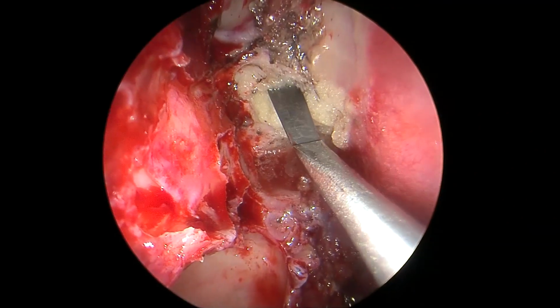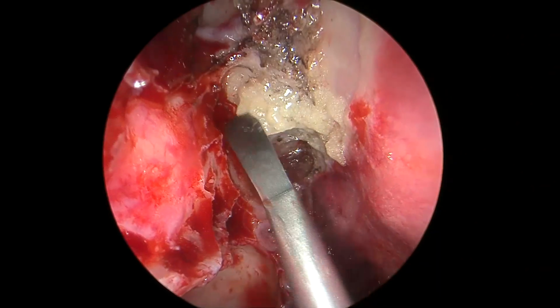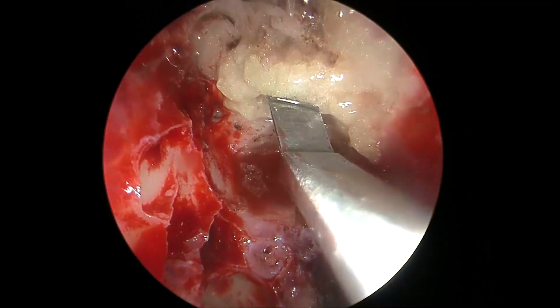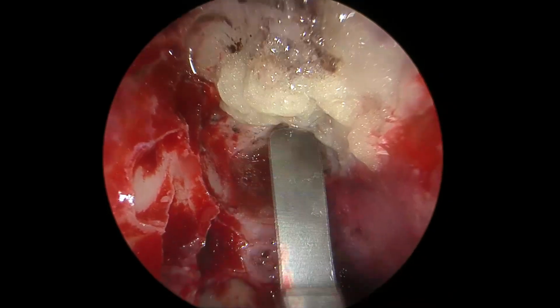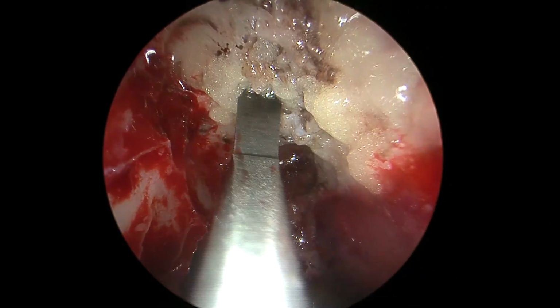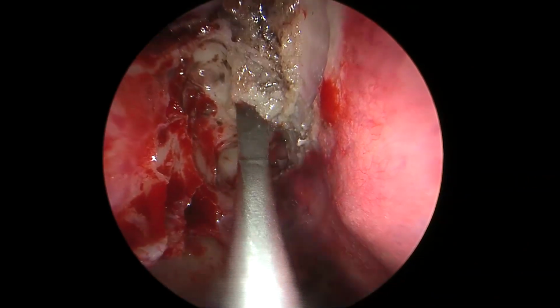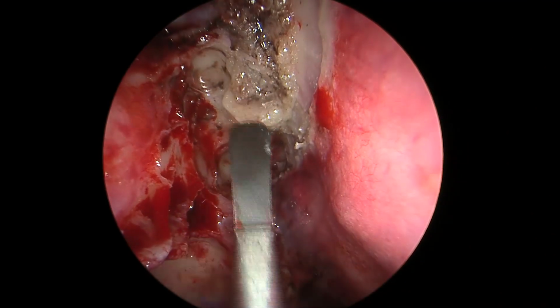You see here, the fat has been reasonably snugly fit with a little bit of it protruding outside, which we are now pushing gently, slowly and steadily using an angled elevator. We never rush this step. We don't want to push the brain too much or contact the actual brain tissue. These patients are normally given anti-epileptics so as to avoid any brain or dural irritation. Now you see how an angled elevator very neatly pushes the fat just appropriately, and any excess fat on the posterior margins can be simply excised using a fine scissors.